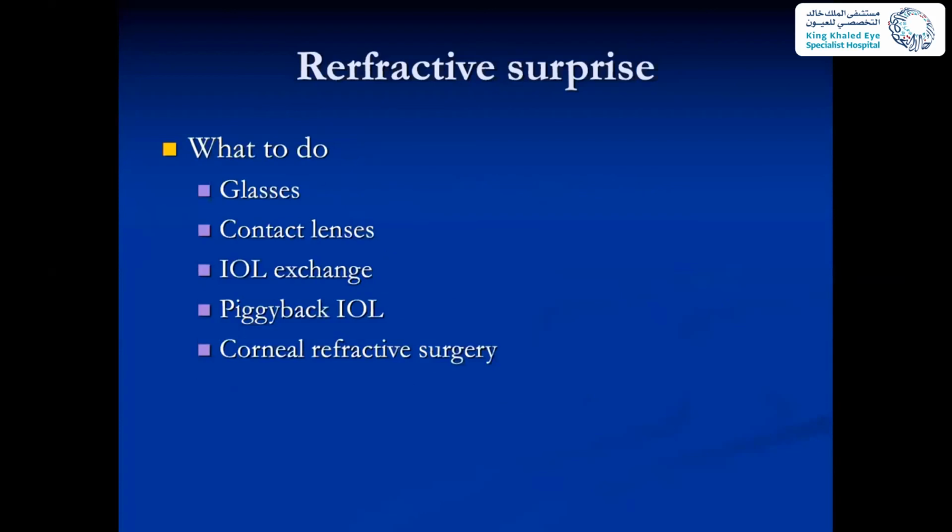What to do? Glasses, if there is a mild refractive error, contact lens, and even IOL exchange, we can change the IOL with the correct one, or we can put a piggyback IOL. There is a certain type that's called Sulcoflex.